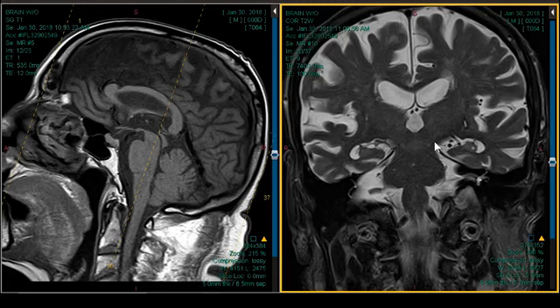Sure. All right. The question was, what if the dementia workup is based on CT? That is, the clinicians, and this is very common, a GP or non-neurologists, for example, may just order a CT as a dementia workup. Well, there's a couple of things you can figure out, right? NPH, or at least a suspicion of NPH. Ventricles would be big. You could see transependymal spread on a CT.